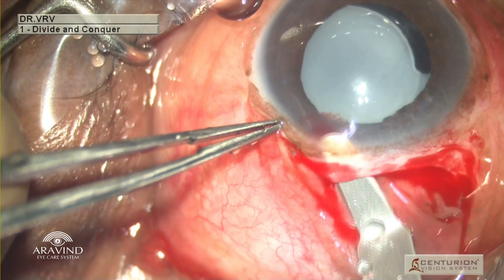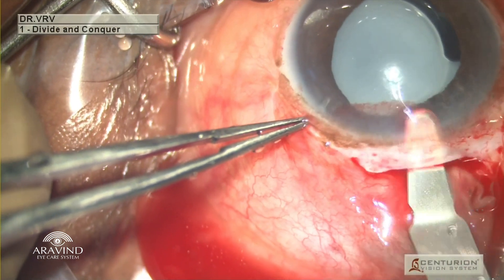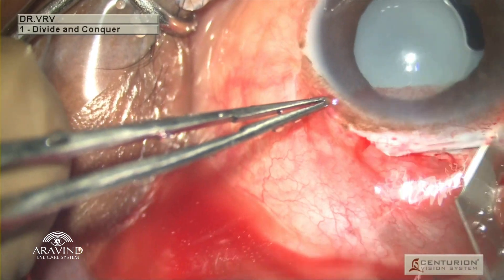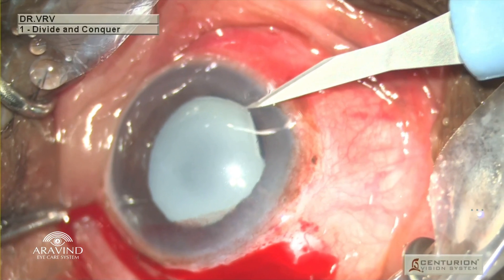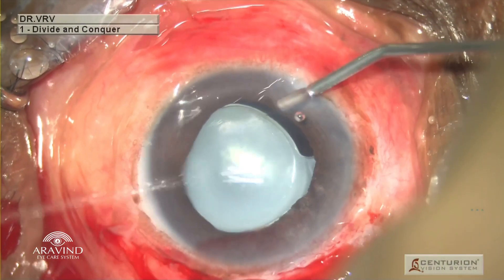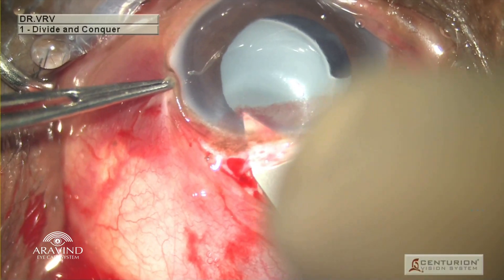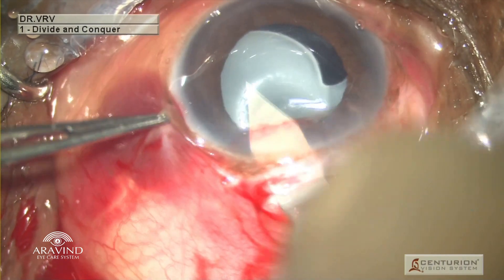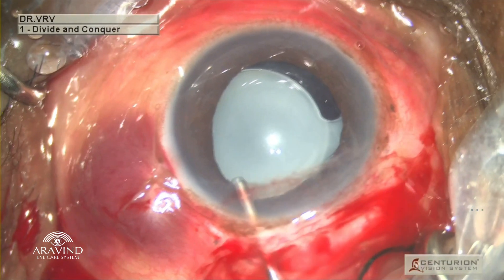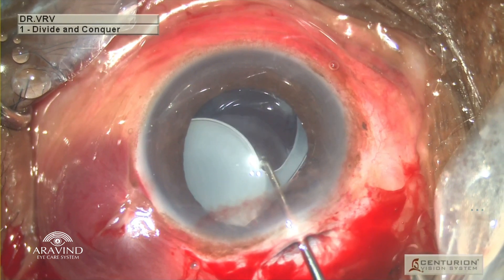It's very important that we create a tunnel a little bit anterior to the corneal scar from the previous tunnel. Using a 1.6 mm super blade, a paracentesis is created at the nine o'clock position. Viscoelastic is injected, and using a keratome the anterior chamber is entered and the wound is extended on either side. The anterior chamber is again filled with viscoelastic.